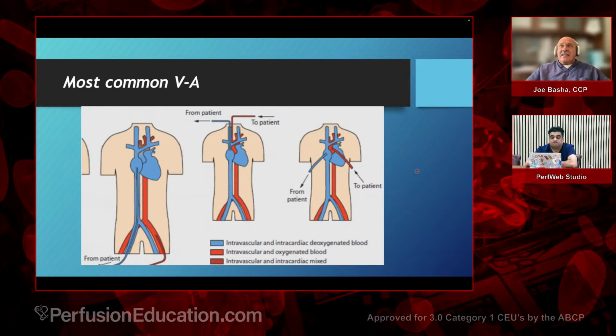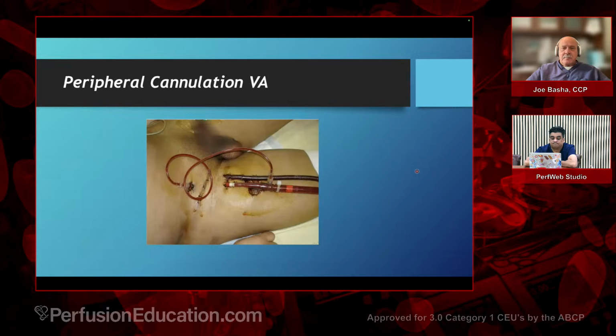Whether it's clinically significant or not, approximately 8 to 10% of patients on VA ECMO will develop Harlequin syndrome clinically significant enough to require intervention via a conversion from VA ECMO to VAV ECMO. That's the data. Those are the numbers that are published.